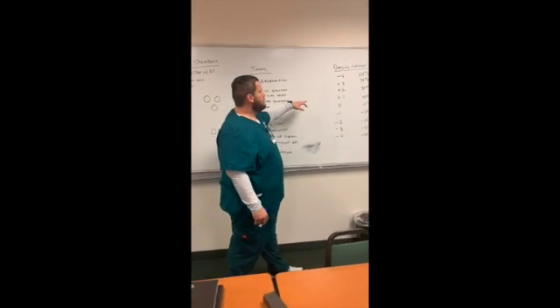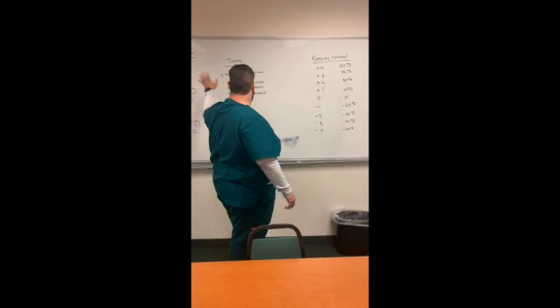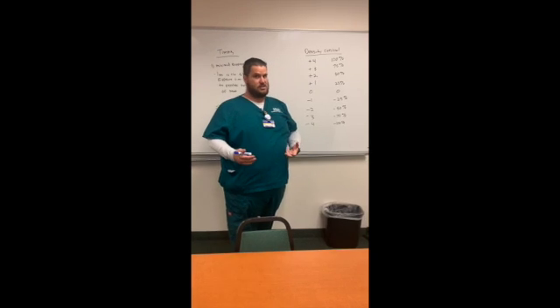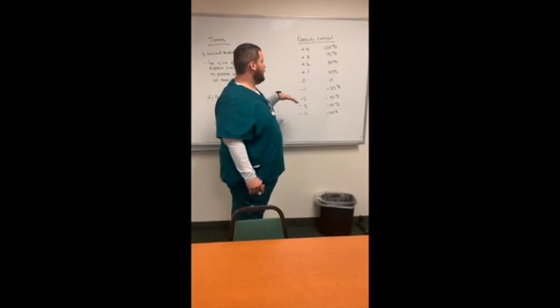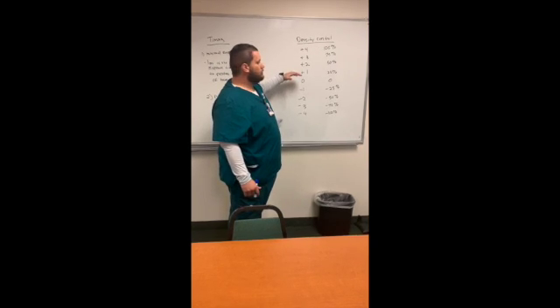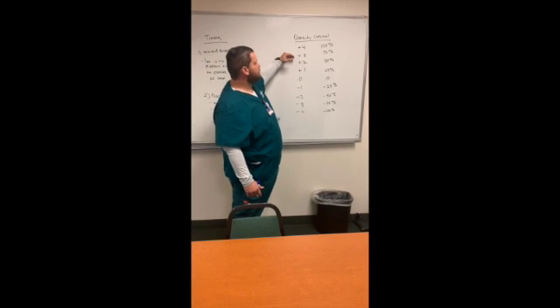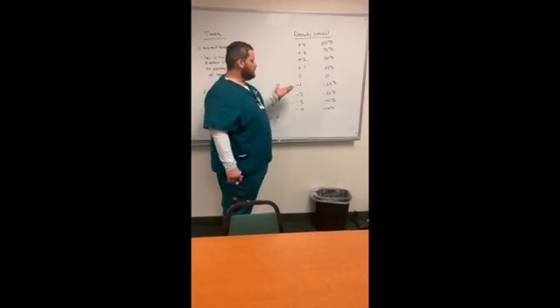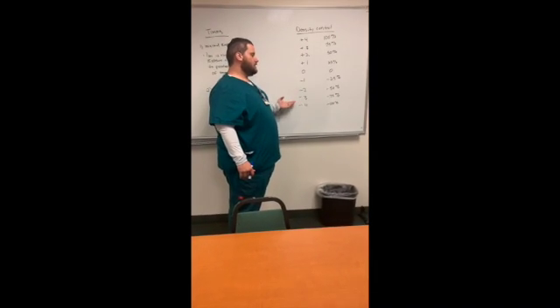As you can see here, the density control: as you select the AEC chamber, you can select the density control of said AEC chamber. Obviously 0 is the neutral, and as you go up, it goes in percentages of 25%, 50, 75, to 100, and also in the inverse, it goes negatively 25, 50, 75, and 100.